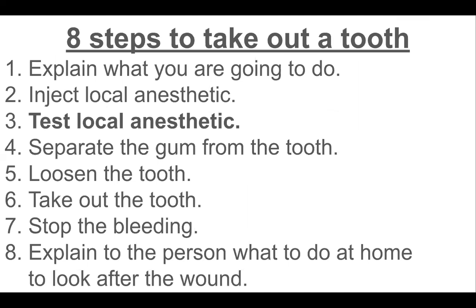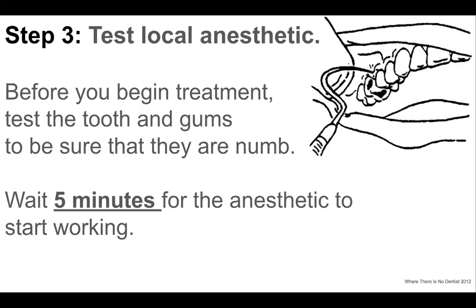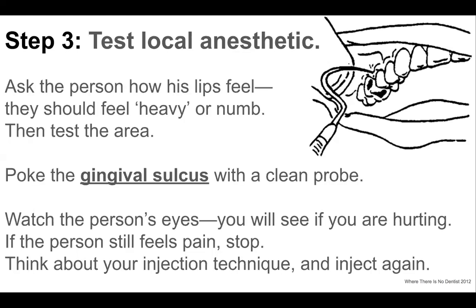After that, we need to test for local anesthetic. You can ask whether he feels any numbness, or you can use your probe to touch the gum and ask the patient whether he or she feels pain. Remember, we need to wait for 5 minutes for the anesthetic to start working.